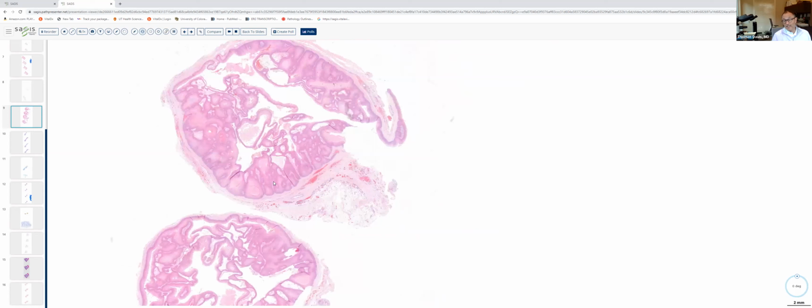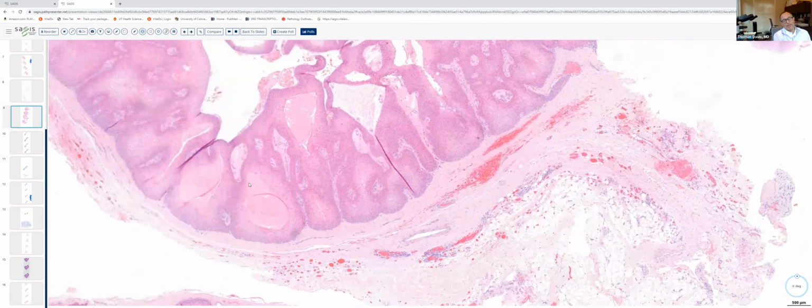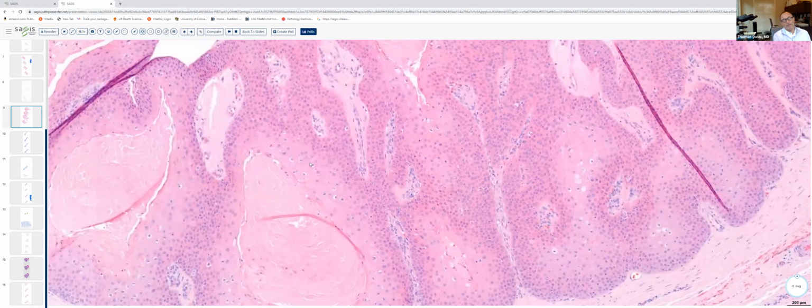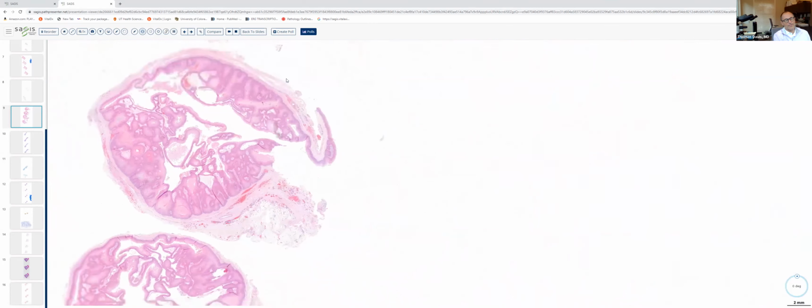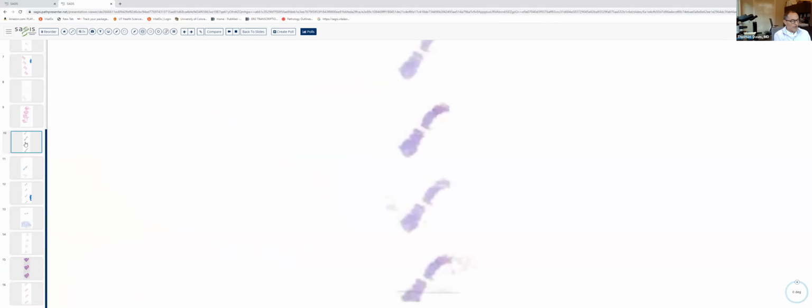Occasionally, one can see malignant degeneration within these tumors, and some people refer to that as a tricholemmal carcinoma or proliferating tricholemmal cystic squamous cell carcinoma. In that particular instance, however, one tends to see striking cytologic atypia with readily identifiable mitotic figures and striking nuclear pleomorphism and/or necrosis. So fairly uncommon occurrence, but this is our proliferating tricholemmal cyst. Okay, let's go ahead and move on to our next case, shifting gears here.